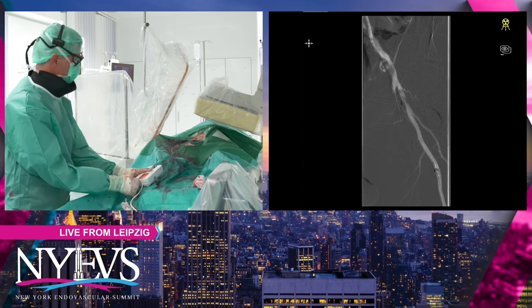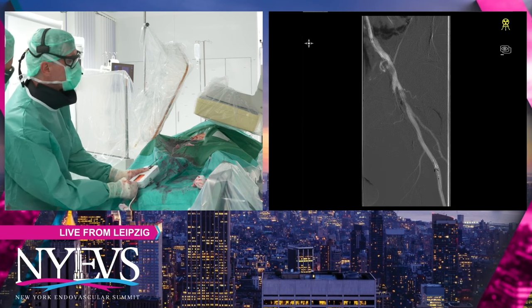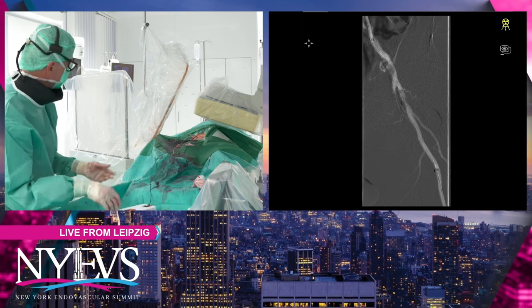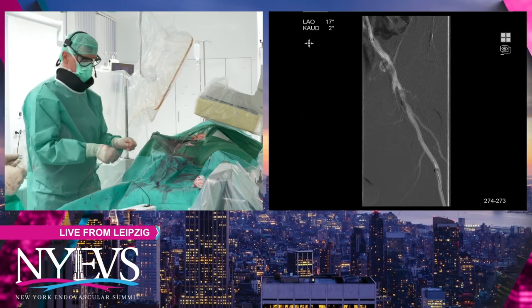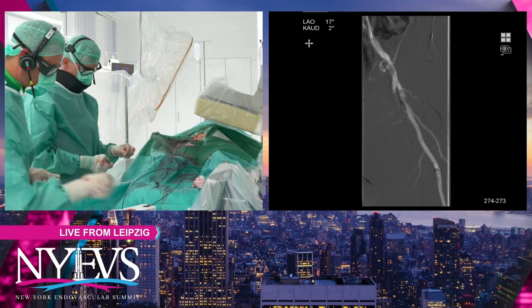Dan, anybody else? One of the techniques that the Koreans taught me for things like this is to use the RX system quite a bit. As they drill, they'll clean it and work it back and forth. They'll take all those hanging chads of debris we develop in the lesion to clean it up. And it's also very useful for CTOs.